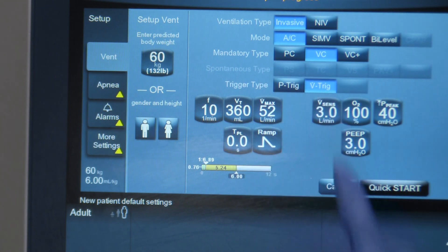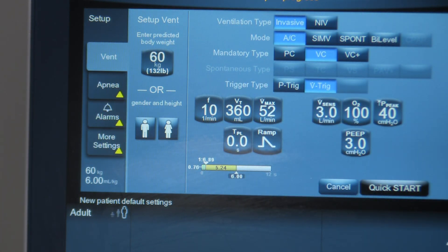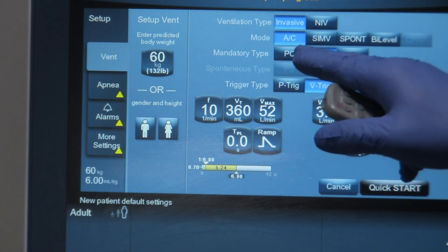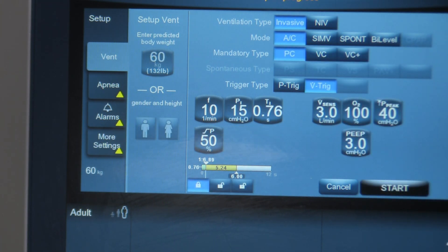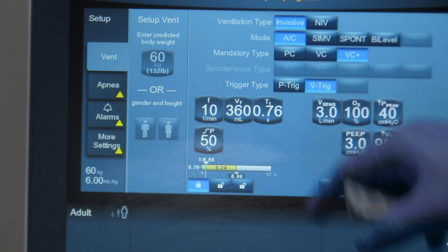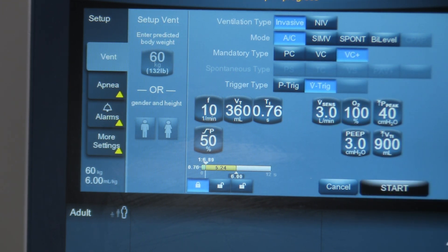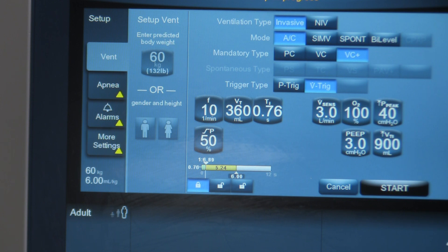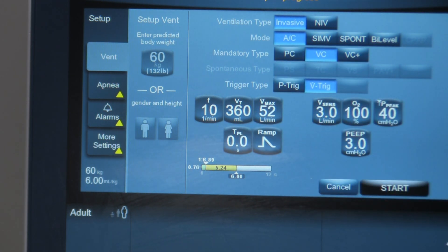Underneath that it says mandatory type — that's the breath type you want your patient to get. You can choose pressure control, volume control, or VC+ style breath. VC+ means it's a volume-style breath but the ventilator will pressure-ventilate in order to deliver the tidal volume you want — very similar to PRVC-style modes on other ventilators. The default is volume control.